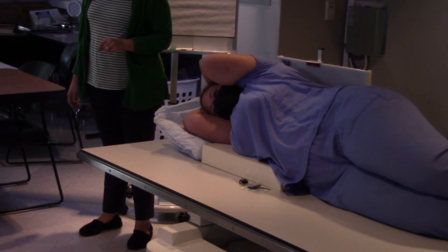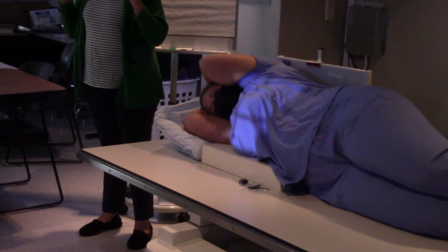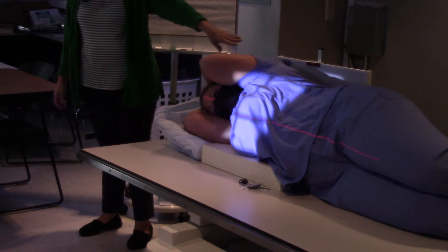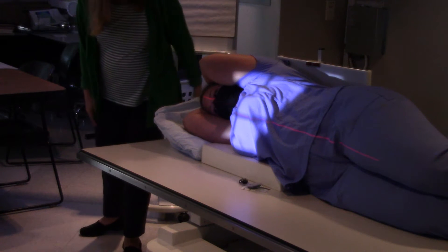You can mark it anatomically, because this is anatomical — you just chose not to use the right-side marker. You can always mark it anatomically and it will be correct.